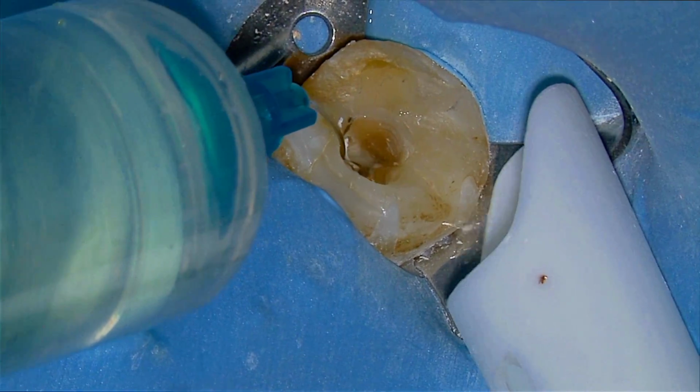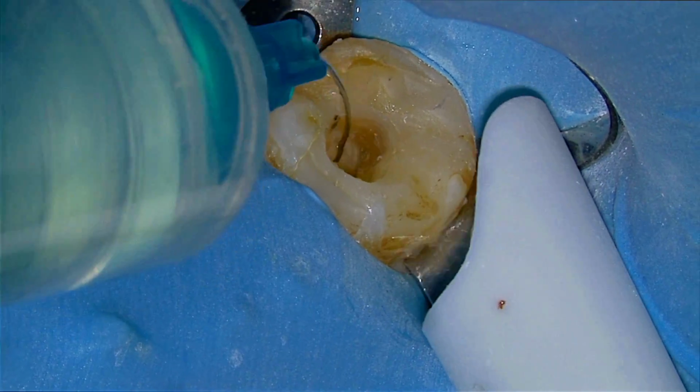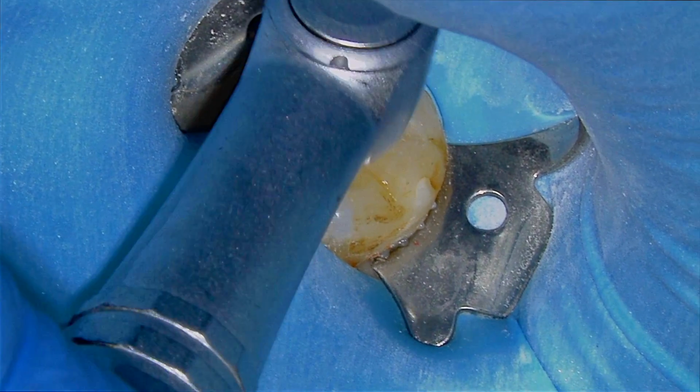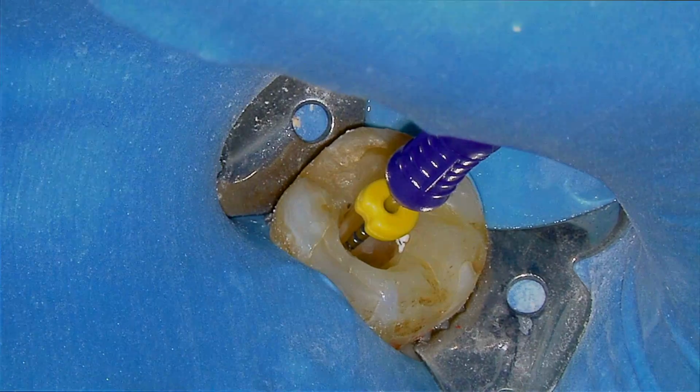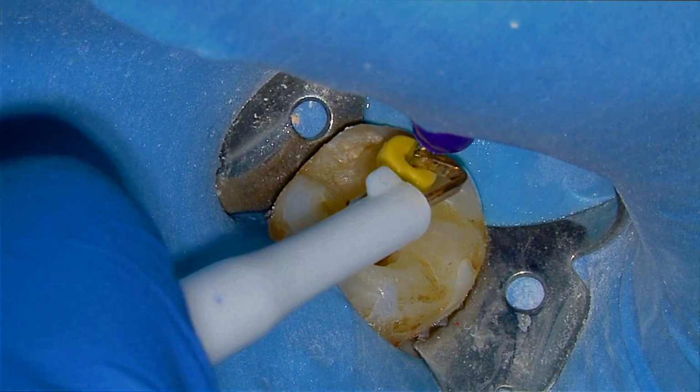So then what I'm going to do is rinse with sodium hypochlorite. So we'll irrigate all the canals, and then we're going to take our Wave 1 Gold in the proper motion, reciprocation. I'm going to take that to my working length that I have from before, which is 18 millimeters, and then we're going to take our working length with our apex locator.